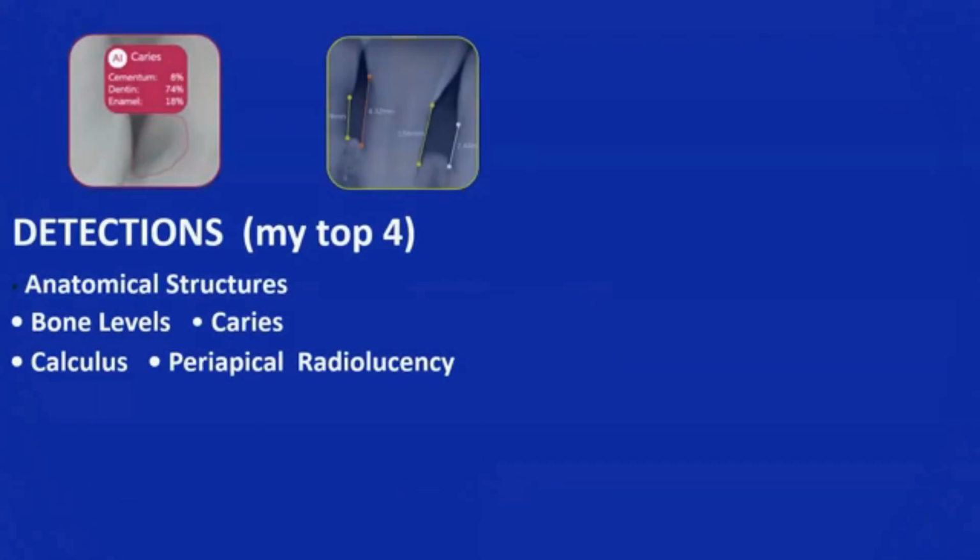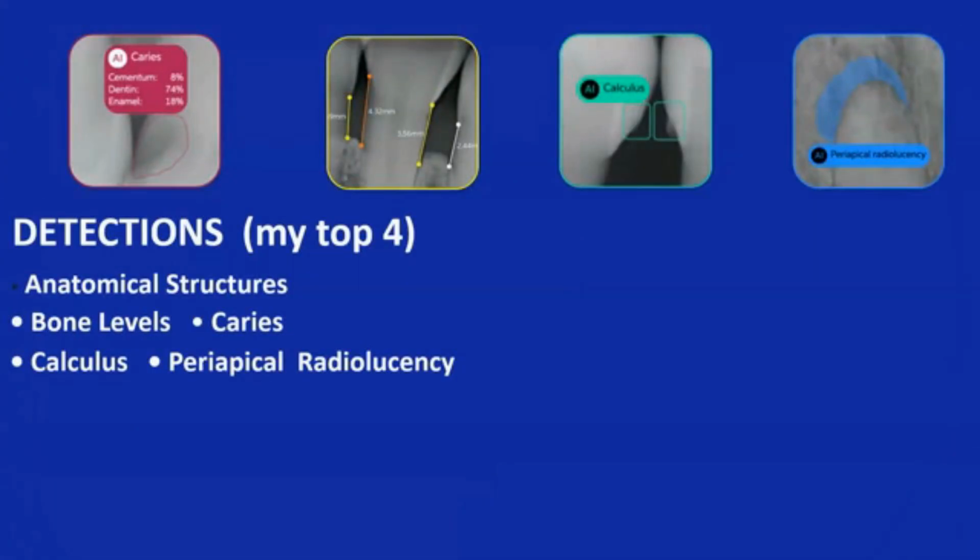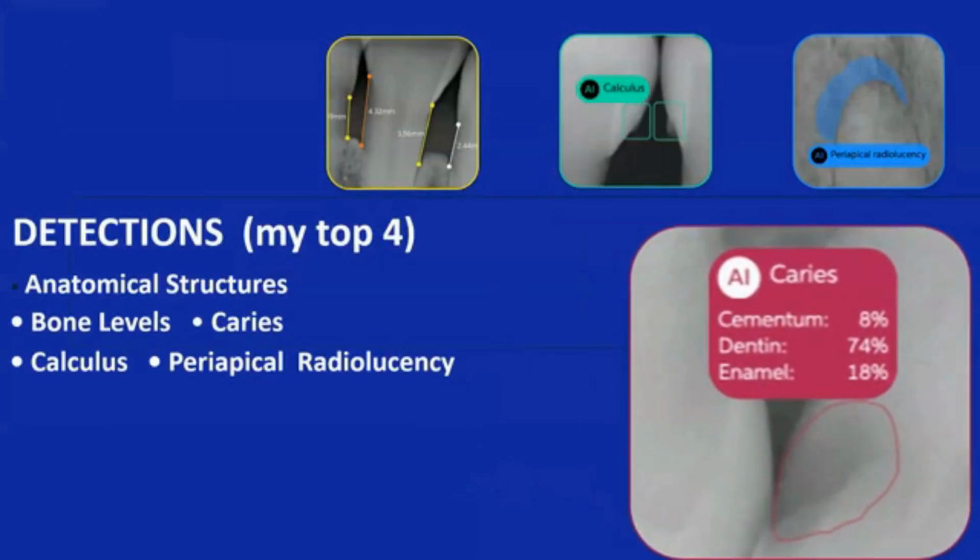Okay. Basic things that I'm doing with this now to save time and to make treatment more effective. The first, of course, is caries detection. Caries is just different shades of gray in a different pattern on the radiograph. Machines are great at picking that up. They pick up things all the time that are significant and very minor, even things that don't need to be treated. Very early decalcifications that I would never notice can be noted and stored there. That image, I can look at it later and see if something has progressed. It's really amazing.